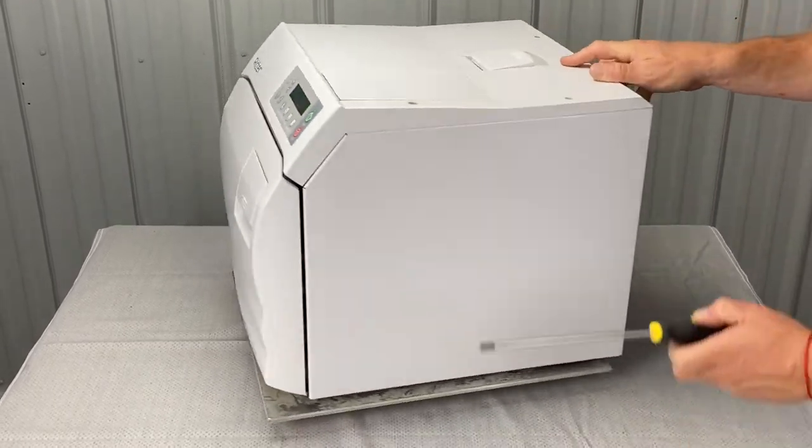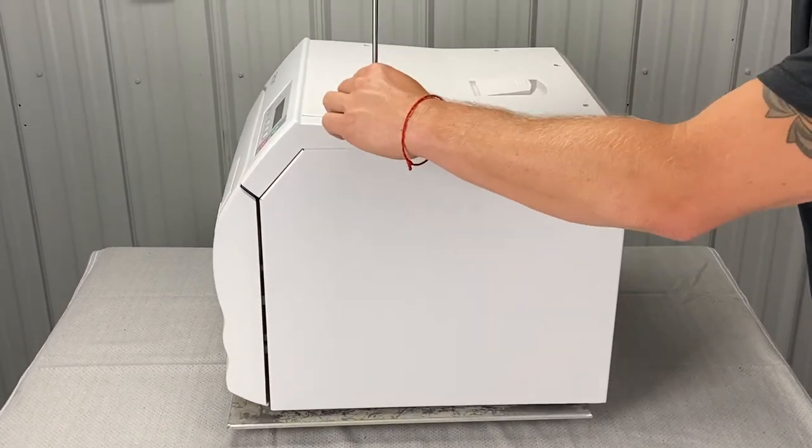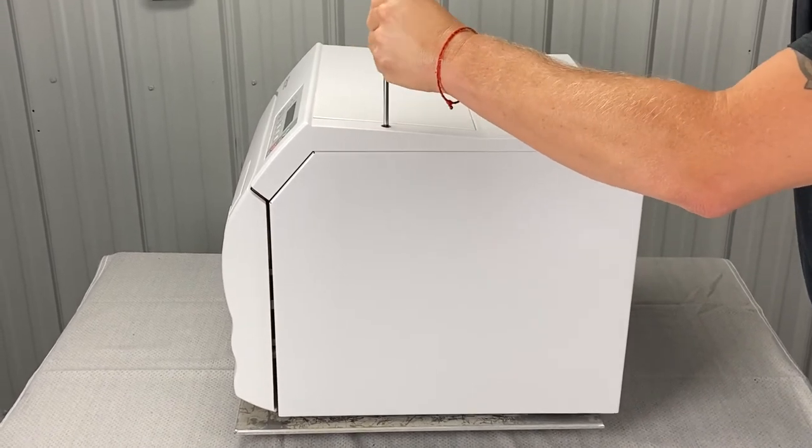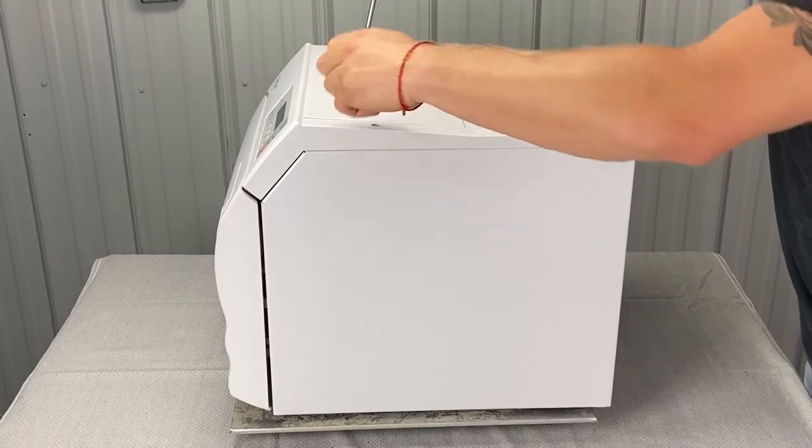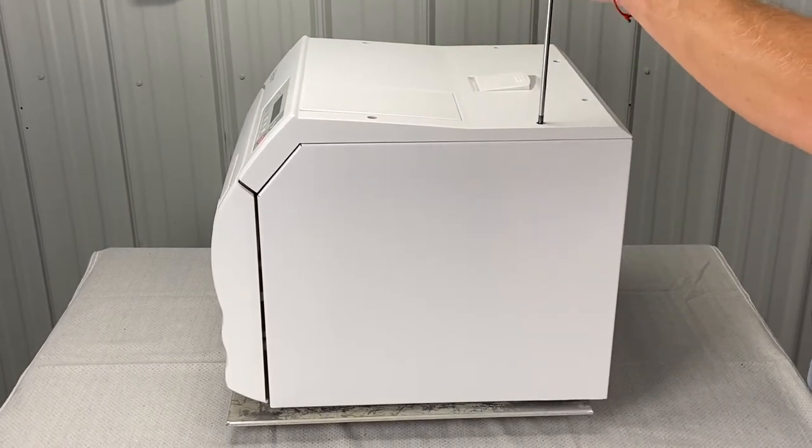What I would start with is either side — it doesn't matter. I'm going to loosen the screw up here. There are four screws on the top. Loosen this screw and set it aside — don't lose them, they're a specific size.